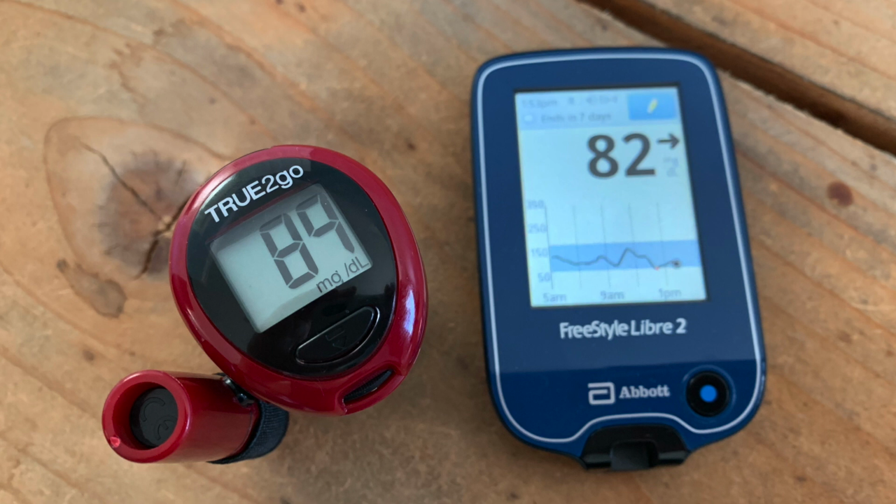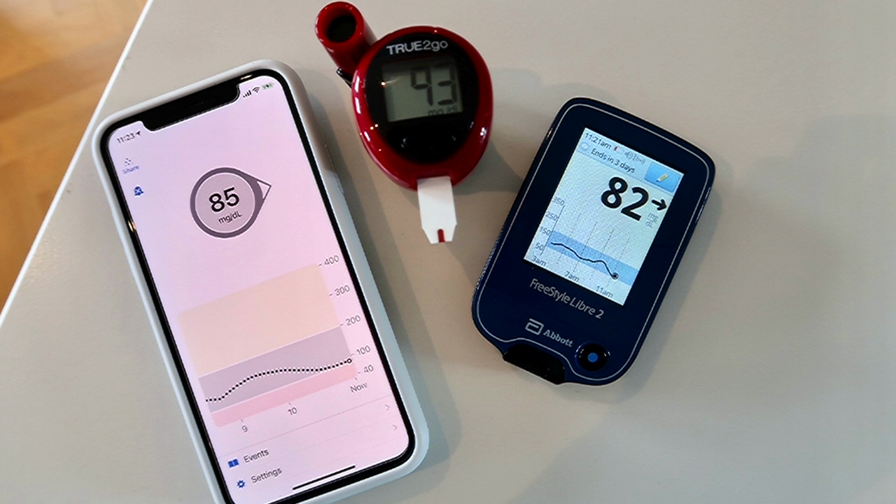We all have a different physiology, and a lot of people commented on my Freestyle Libre 1 video that thing just was not accurate for them at all. You've got to kind of try out the system, test it against finger pricks, and build your own trust or mistrust of the system. But for me, speaking personally, I thought the accuracy was pretty darn good. Not as good as my Dexcom G6, but pretty darn good. So let's go through some pros and some cons.